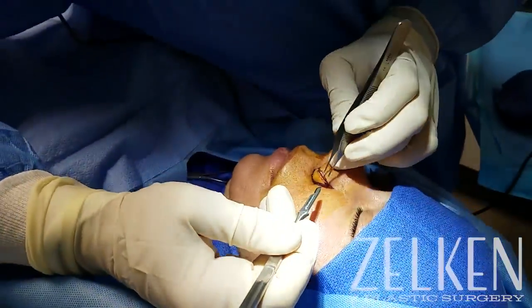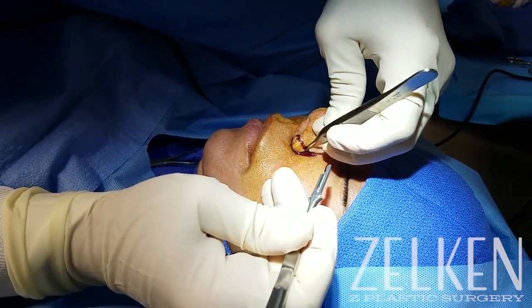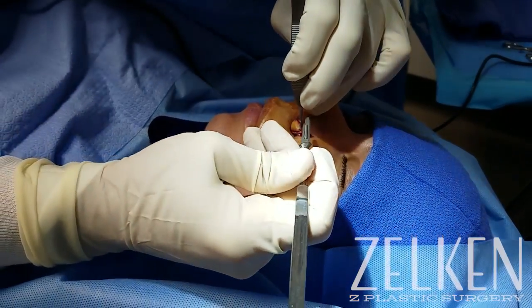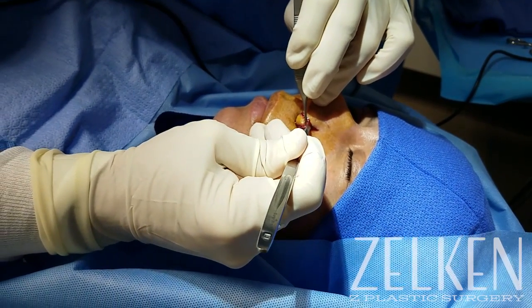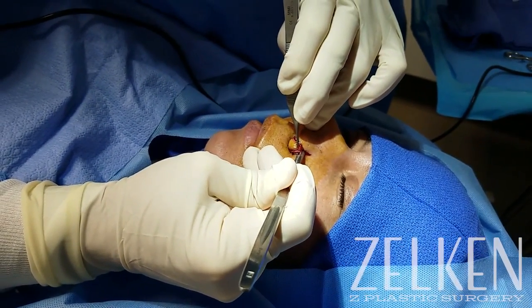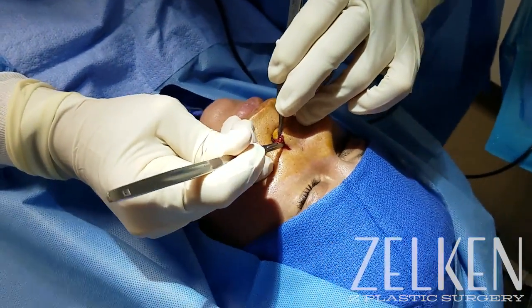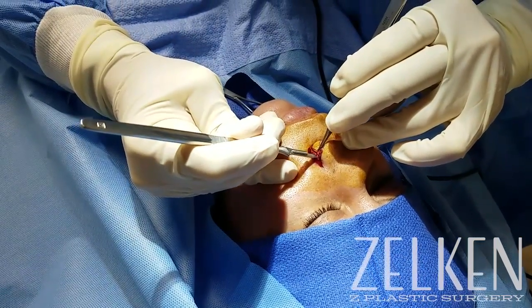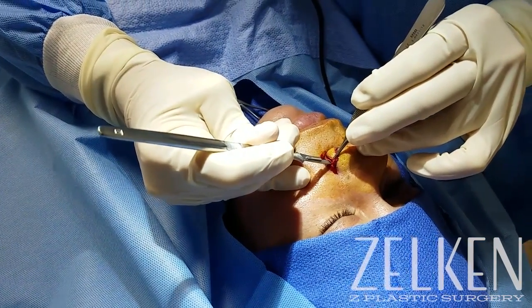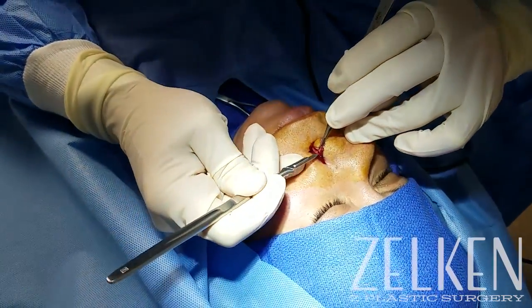The procedure should be performed under sterile conditions and OR conditions, whether or not it's performed in the OR or in the office. Obviously, this is a clean, contaminated case, but every effort should be made to keep this as sterile as possible. I use a betadine prep for this operation and I also give the patient a compounded pill that includes Valium, Percocet, and Zofran. All of these help with nausea, vomiting, as well as pain control and anxiety.